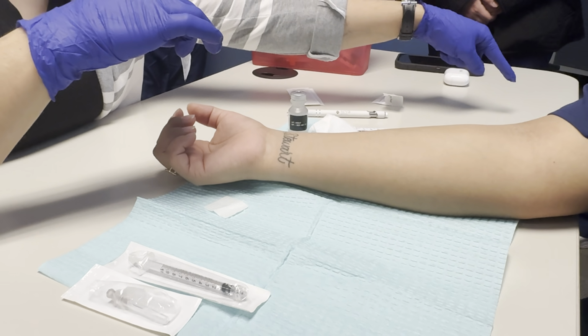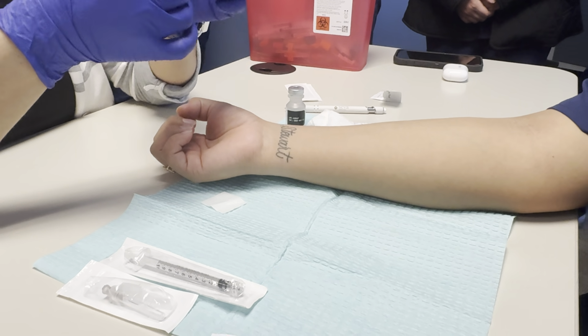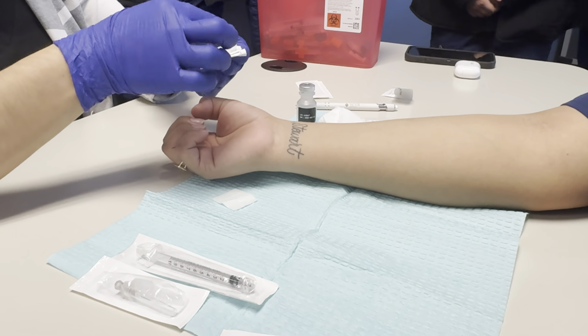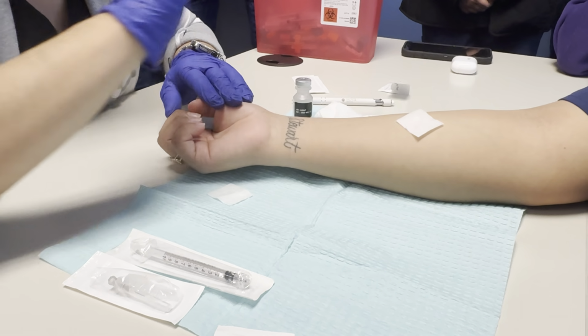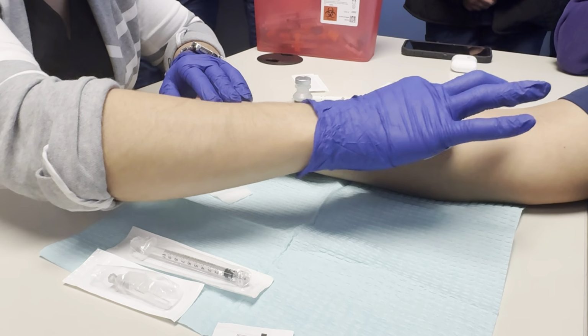You can grab a chair and come sit right here. Matt, can you get a chair? I'm going to show you one more time, okay? That way you're not blocking them and you're able to see. So I'm going to go ahead and grab my alcohol wipe. I'm not touching it again. My gloves are not clean. So I'm just going to drop this right here where I want to go. Start from the circle, and I'm going to work my way out.